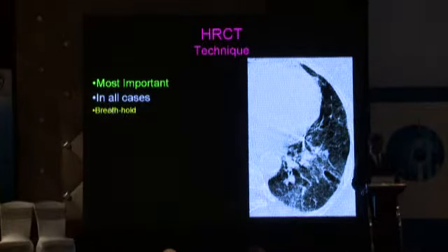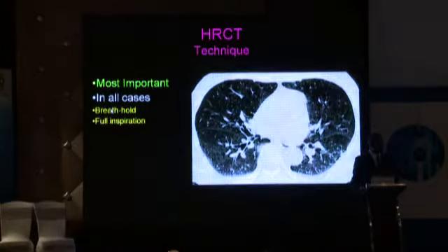So we need extremely good breath hold, and the technologists or the nurses or the doctors, whoever is actually going to instruct the patient on breath hold, needs to explain to the patient in his or her language, something that the patient understands, so that the patient can take a deep breath and hold that breath. This is what we require.